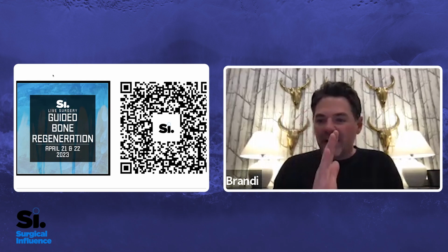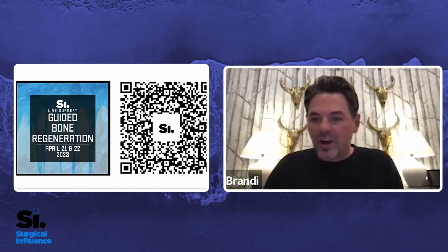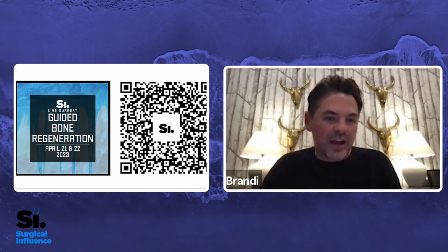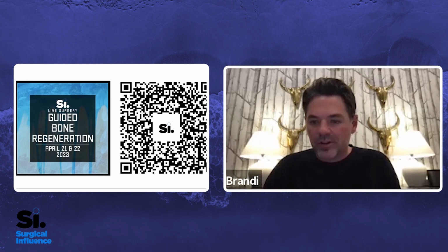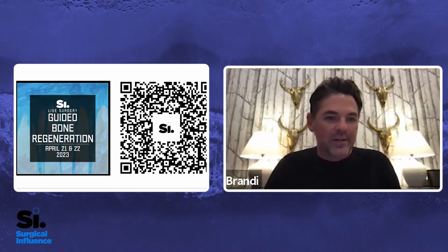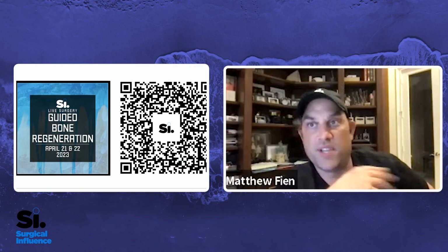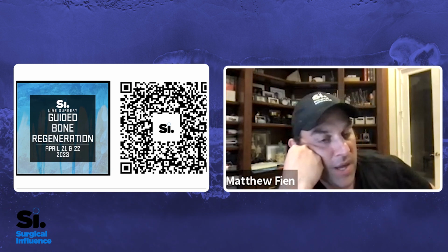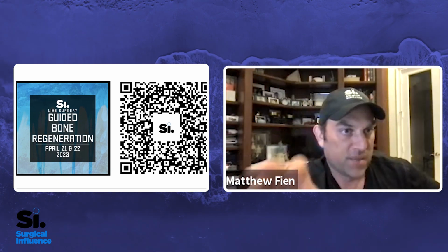But I love those nice anterior defects, almost like a bowl that's just waiting to be augmented. As long as you have the height, I think horizontal defects are so predictable. Building width is so much easier than building height, and you guys have mastered it 100%. Looking at some of the cases we showed tonight as we wrap up here, it's all the same technique no matter what materials you're using. For the most part, it's the same principle, same technique.